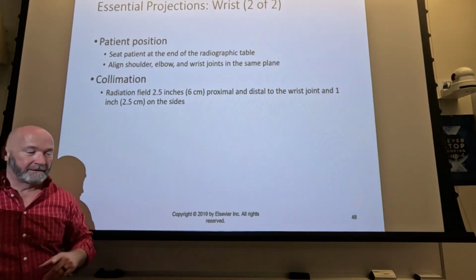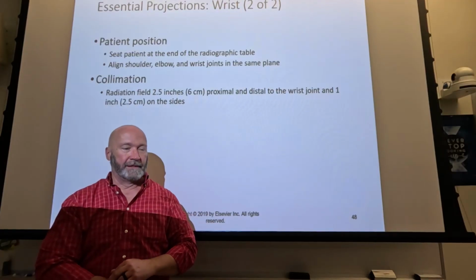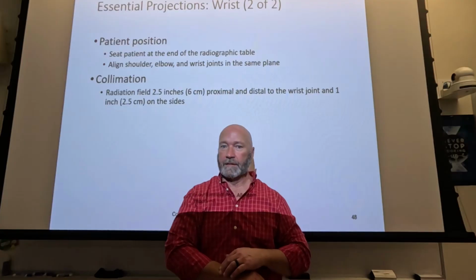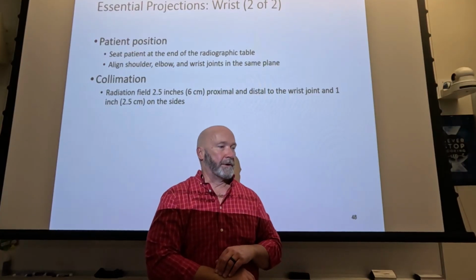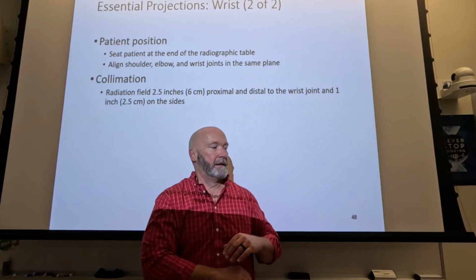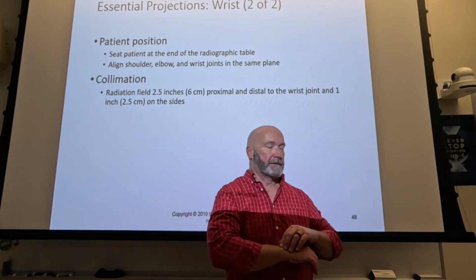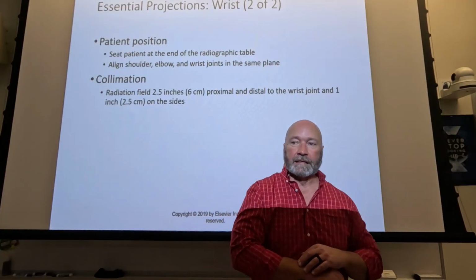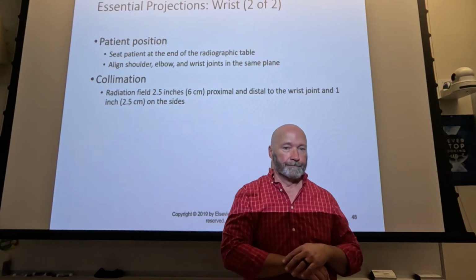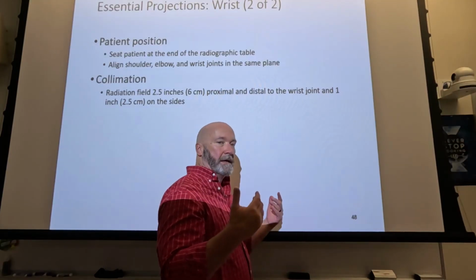This is weird. Okay. So put your hand down just right on your desk, and you feel that knot on the back of your wrist. That's the ulnar styloid process. If you read through the evaluation criteria in the book, it's going to say that the ulnar styloid process needs to be in profile. What's a profile? It's a picture from the side, right?